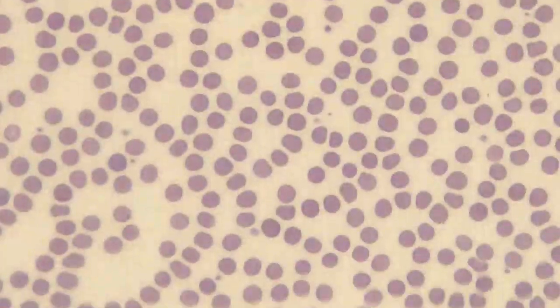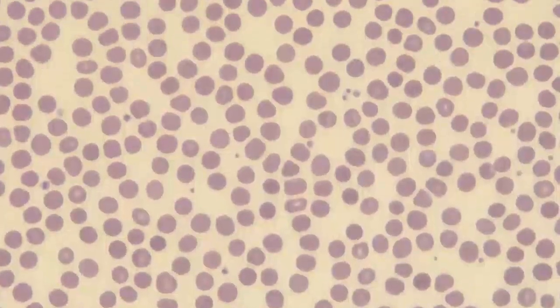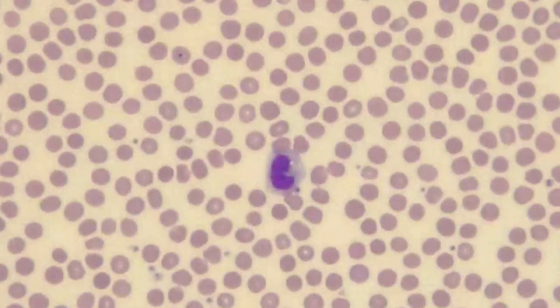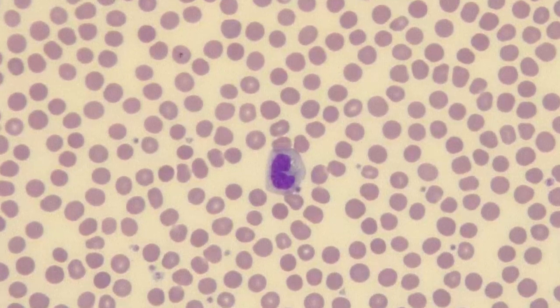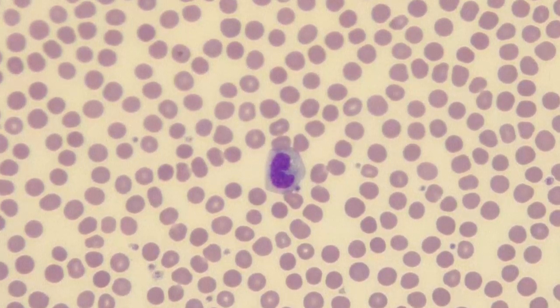And let me see if I can find a good example of a monocyte. Okay, so here's a monocyte, and as far as judging if the staining of the slide is good, I would say it is, because monocytes tend to have a cytoplasm that's kind of this grayish color, and I see that in this monocyte. And the nucleus is also kind of this dark purplish color, but not as dark as, for example, a small lymphocyte. So this looks pretty good.